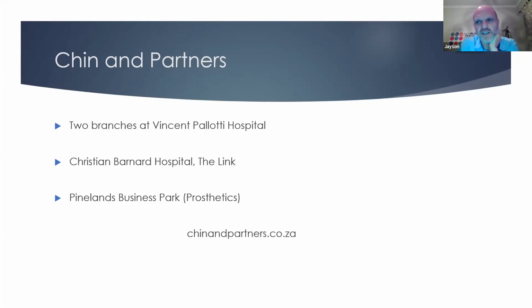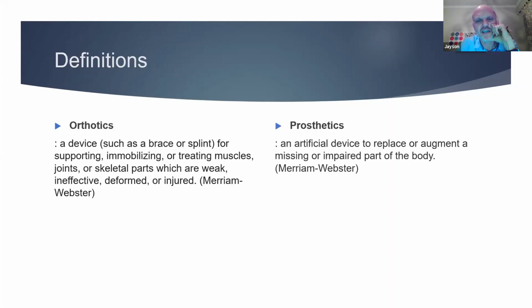So orthotics and prosthetics is a field that's evolved a lot in recent years as we've moved on from metals and leathers to composite materials and fancy plastics. And it's very diverse, and often clinics and different areas have different patient profiles, and this sort of defines the types of orthotics that one sees particularly. So orthotics is a supportive or corrective device.